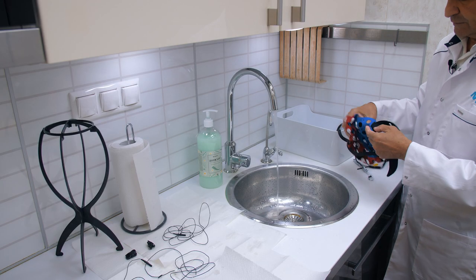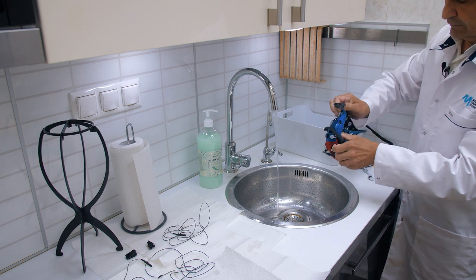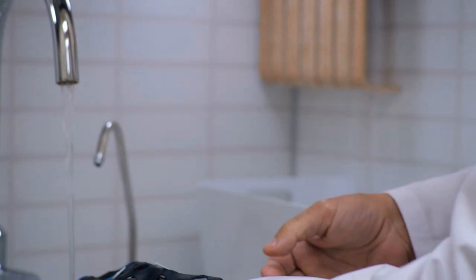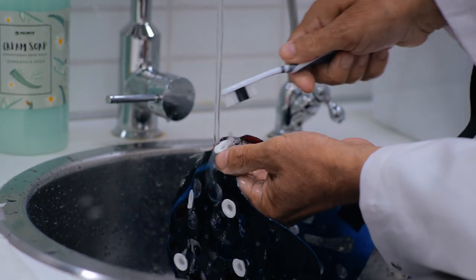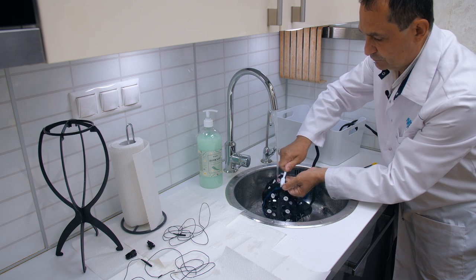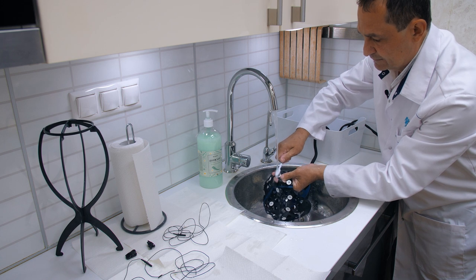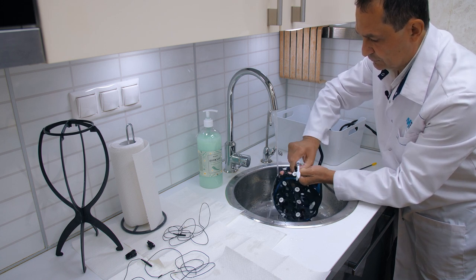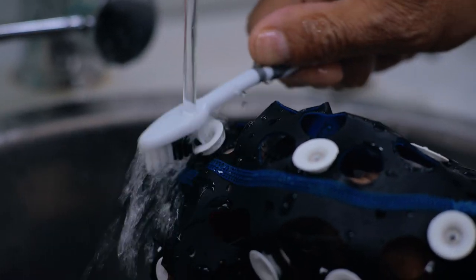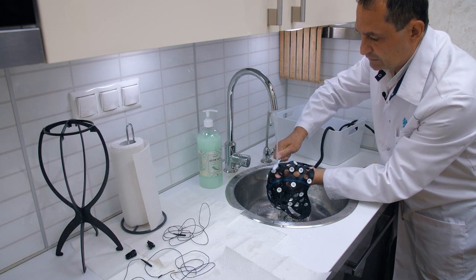Thoroughly wash the carbon surface and then meticulously clean the holes with a special brush. Once the clips are done, proceed to wash the hat itself. Reverse the orientation by turning it inside out to expose the inner sides, and commence flushing each individual electrode — preferably following a specific scheme, such as along the sagittal line, in order to avoid missing any electrode. It is crucial to completely rinse off the gel, because if it dries it transforms into a film that renders subsequent registration unachievable.